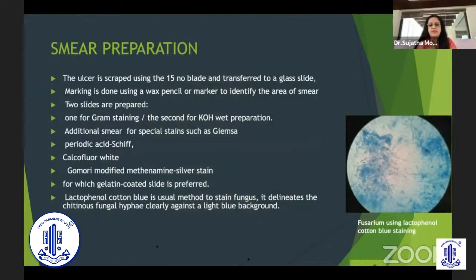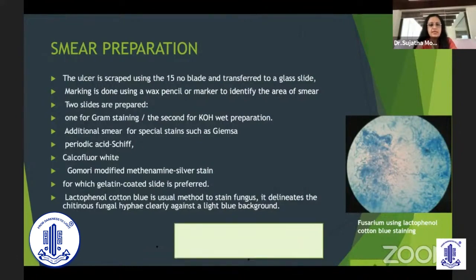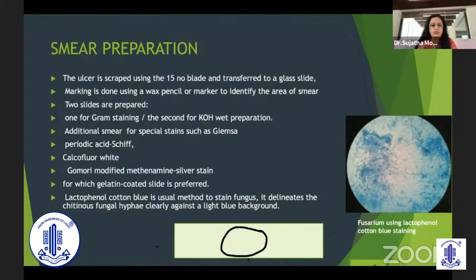Smear preparation: once the ulcer is scraped with a number 15 blade, it is transferred to a glass slide and marking is done with a wax pencil to identify the area of the smear. Two slides are normally prepared — one for gram stain and one for KOH stain. If you're suspecting something other than bacteria or fungus, additional stains can be done.